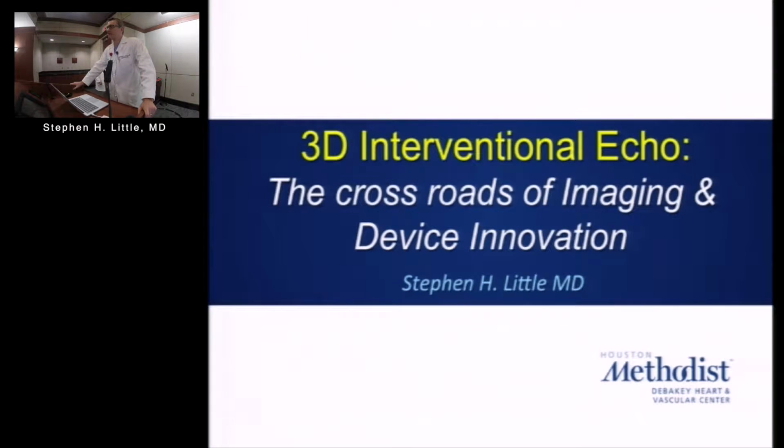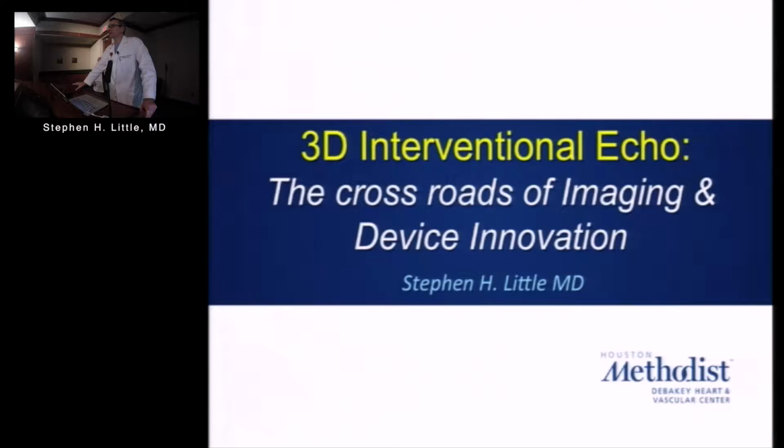We're going to adapt that a little bit and talk about applications of 3D echo, largely for interventional echo. So for the sonographers in the room that aren't actually acquiring images during a TE, know that you probably could actually. I was in Dallas last week, hanging out with those guys in their echo lab and their interventional lab, seeing what they do. It was interesting actually. They had a sonographer in with every case, doing the image optimization, doing the acquisitions during their TAVRs, during their mitral clips, during their structural interventions.